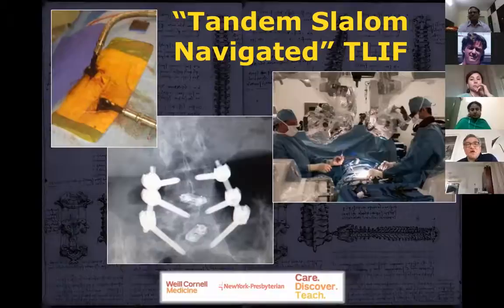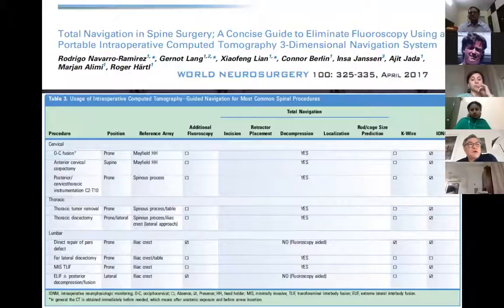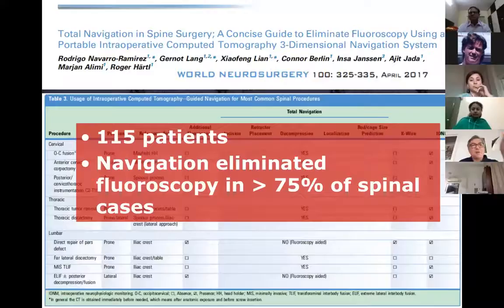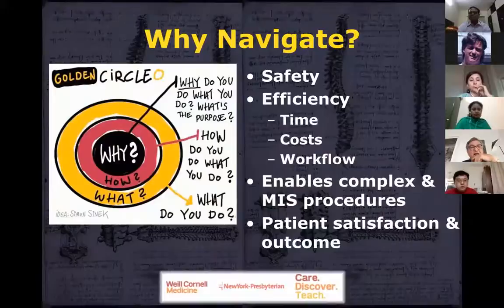So we wrote up our experience with navigation in spine surgery, and it was published in World Neurosurgery a few years ago. And we found that overall in our spinal practice, and I'm talking about not only my practice, but also my colleagues here at Weill Cornell, we eliminated fluoroscopy really in about 75% of our cases. And we think that navigation makes surgery safer.